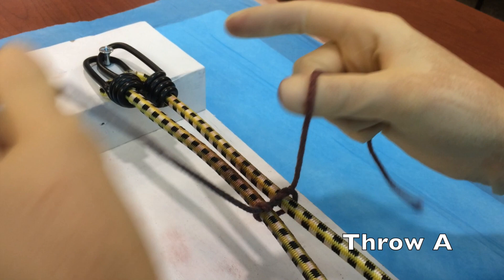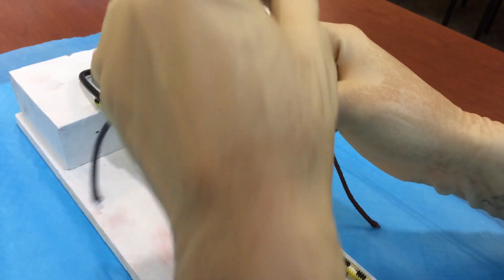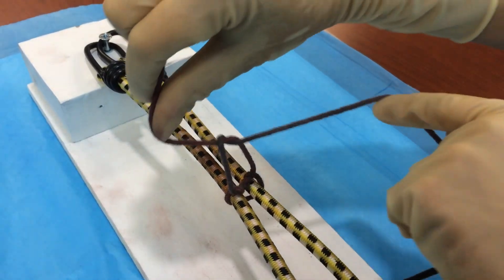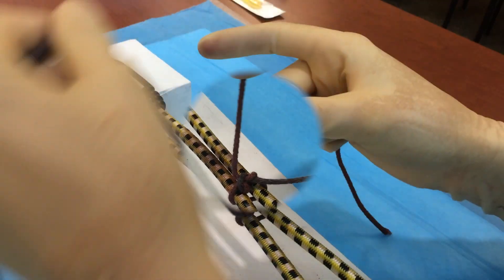Now we're going to talk about the two throws involved in creating the surgeon's knot. We'll call this throw A. Let's first watch it in full speed, and now let's break it down in slow motion.